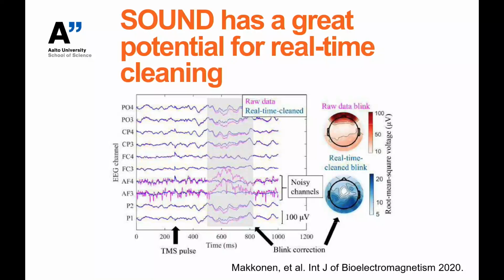It's nice because during recordings you can easily have channels that become bad. They become detached from the scalp. So it's nice to have a real-time method that can respond to these changes. But this is still ongoing work, and we recently got a small grant to concentrate on this real-time cleaning.